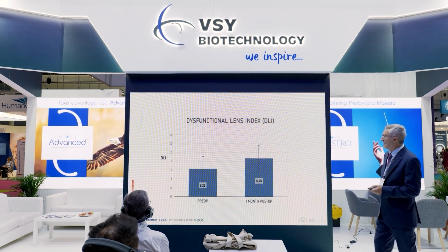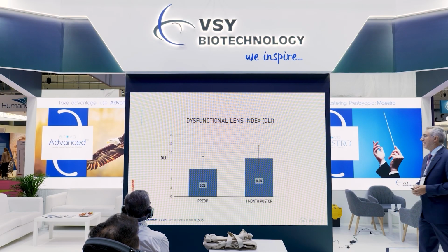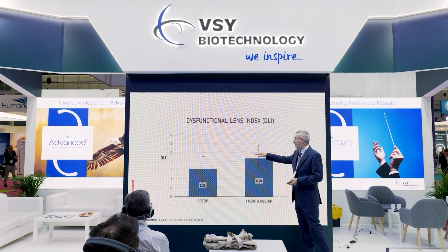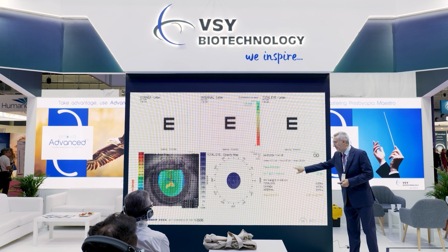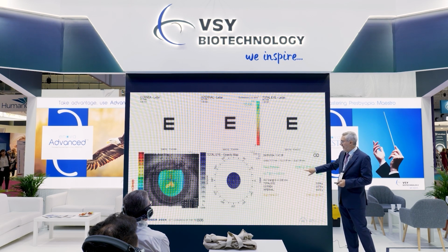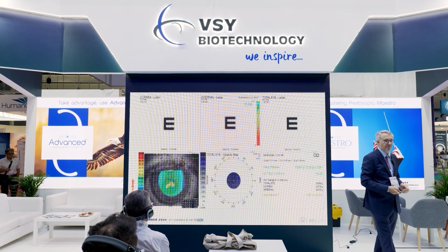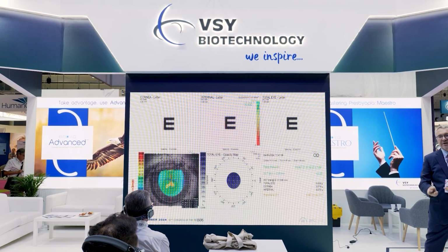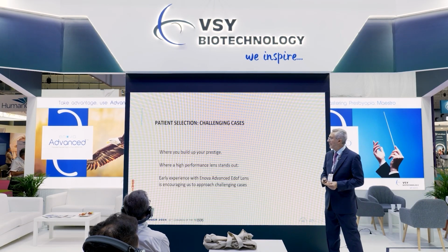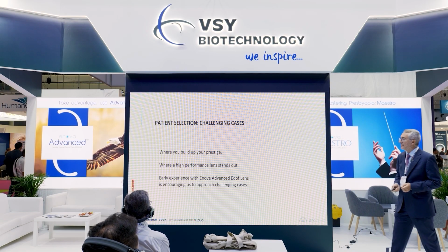So patients are very satisfied about the promises of the FAR vision. And the dysfunctional lens index improves a lot postoperatively and will improve even further. This is pointing out some findings, even without complaints from the patient. We are observing closely the result of this spherical equivalent, and we tend to opt for the first minus selection of the lens after the biometric analysis.